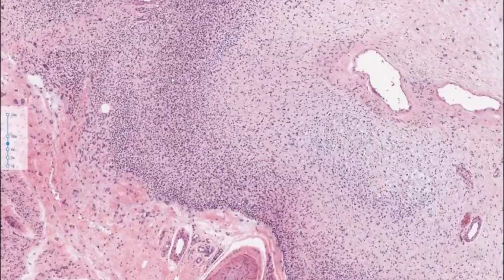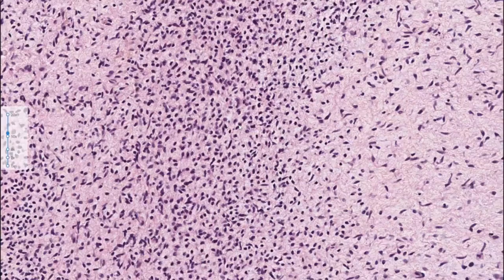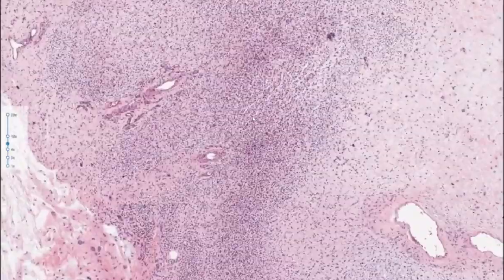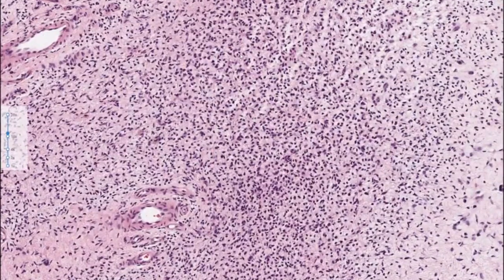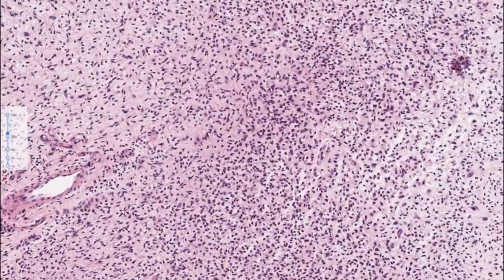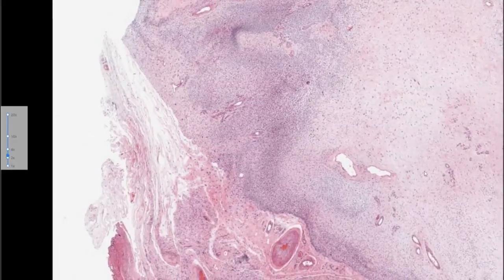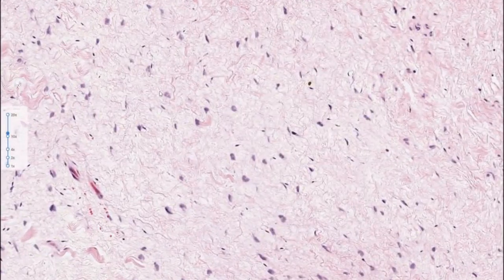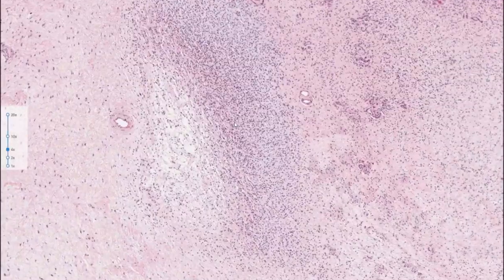More areas of increased cellularity. Something to highlight is that mitotic activity here is not that high, although you can have a few sometimes in these cases. But a very cellular area, again, it worries you when you see it, in particular at low power, you start seeing something that looks very hypocellular. You say here, this is probably a neurofibroma or some sort of nerve sheath tumor, and then something that is extremely cellular in the middle of it.